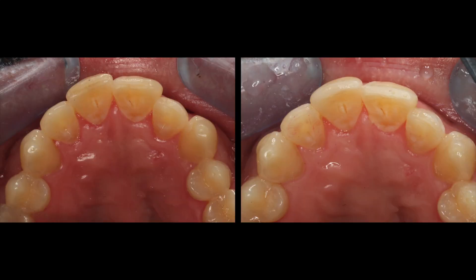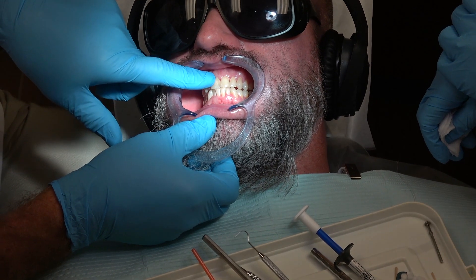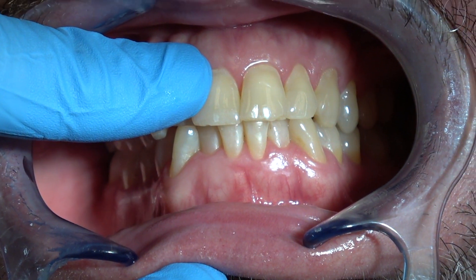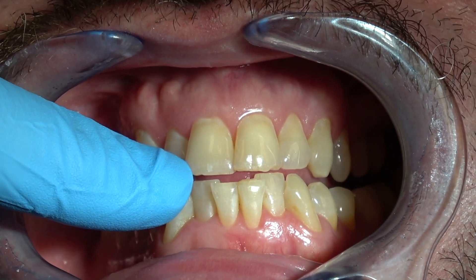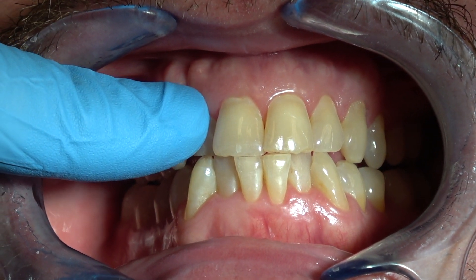From teeth grinding at night without a night guard, you can see how these teeth have worn on the anterior. Slide forward way forward with your lower jaw, and keep your teeth together. Go back a little bit — just what you were doing — there we go, see how they perfectly fit together.